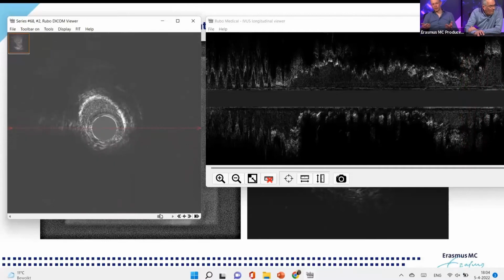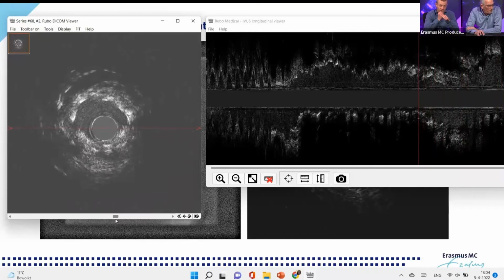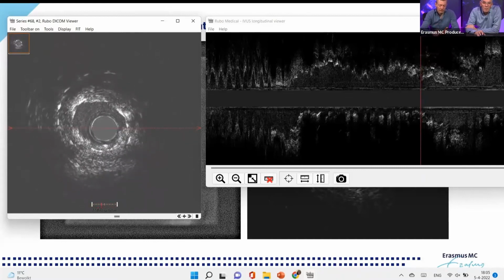So if you do your post-PCI imaging assessment, you in principle look for 3 things. One is you look at the edge, distal and proximal, to see what the plaque burden is with IVUS. If it's above 50%, this is linked to edge disease, edge restenosis and edge restenosis-related events. You look for dissections, particularly dissections covering the media and with a length longer than 3 millimeters, and you look for expansion. Those three things you really need to remember and do at the end of all the pullbacks post-stenting: dissections, plaque burden at the edges, and expansion. And those three things are critical.